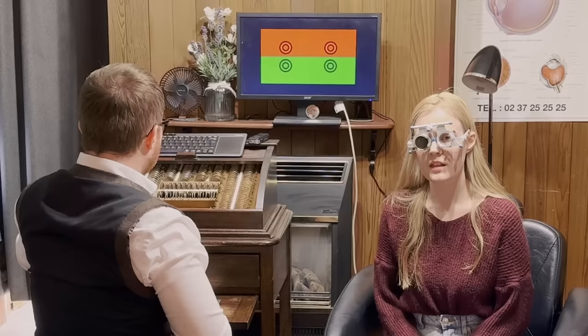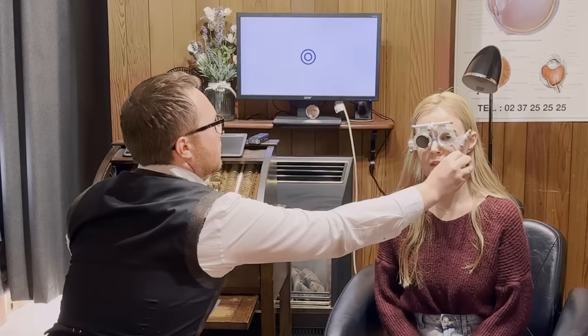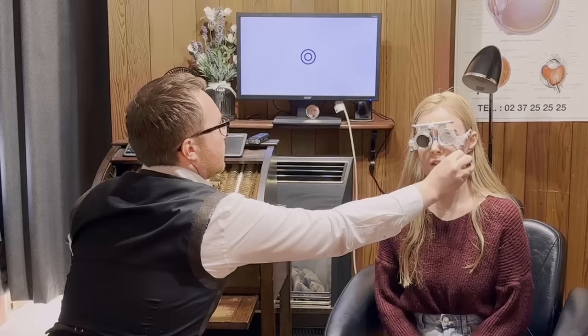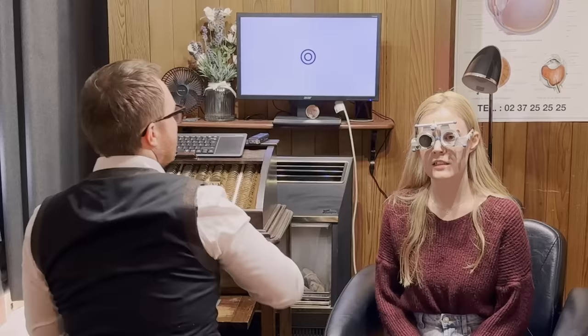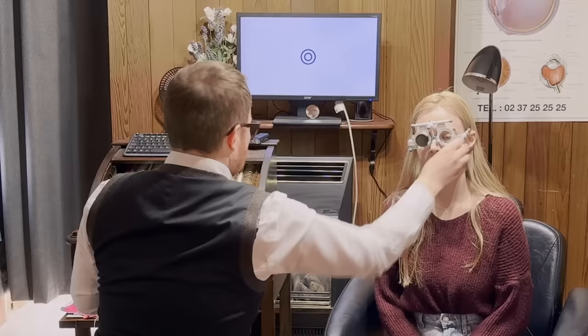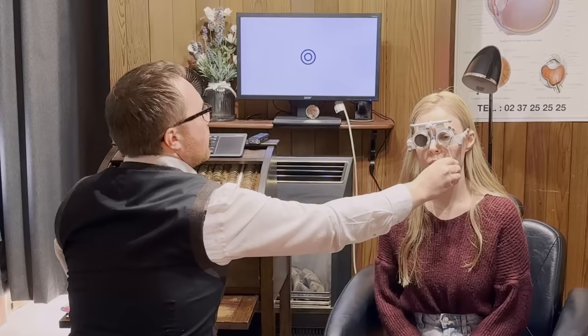Okay, so looking back at those two circles, and I'm going to show you the blurry ones again. So would you say that those circles look rounder and clearer with number one or number two? One there, two there. Two. Yeah. And one, two are about the same. So we've got one, two, or pretty similar? Two. Yeah, two. Okay. And looking at those two circles, are they rounder and clearer with number one, number two, or about the same? I think they're the same, yeah.